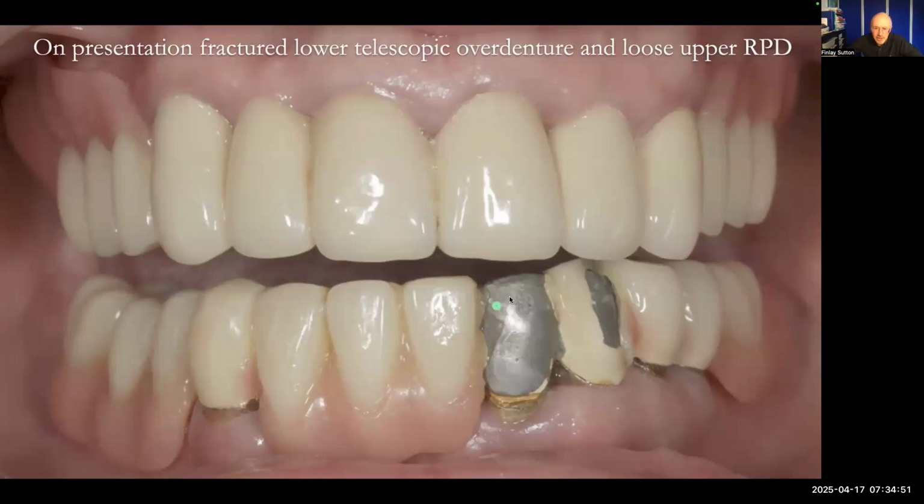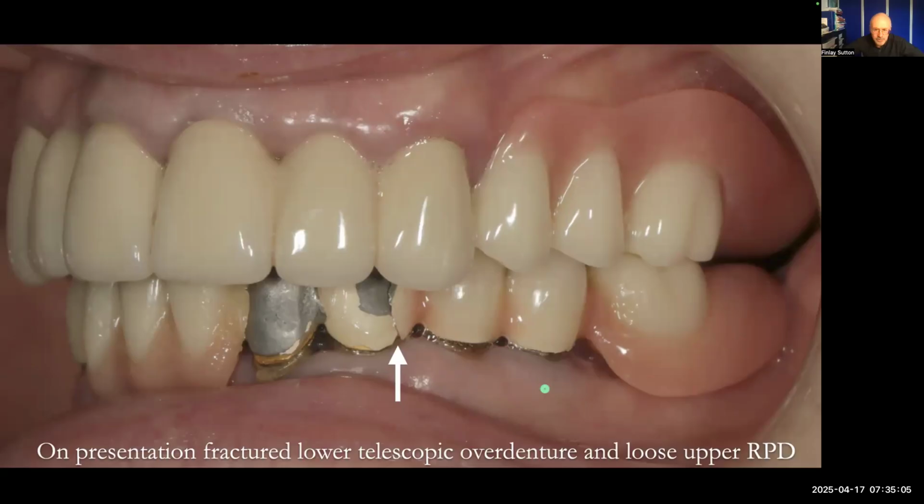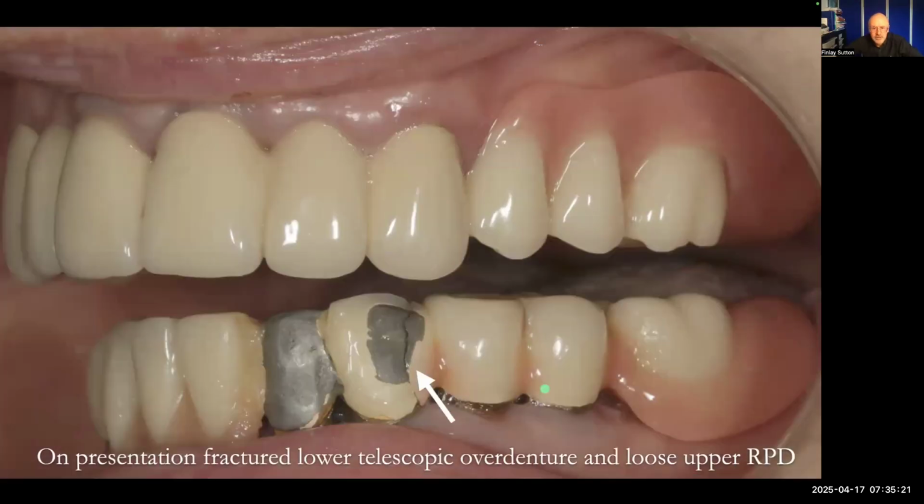You can see that the porcelain's fractured away from the lower bridge, not implant bridge, but the telescopic supported bridge, the bottom there. This is often a problem with these sorts of things because there's a lack of space for all of the restorative materials. It's really tight for room in these areas to put the teeth back in the right place and also for the whole thing to be quite strong as well. So that's where the bridge had fractured.